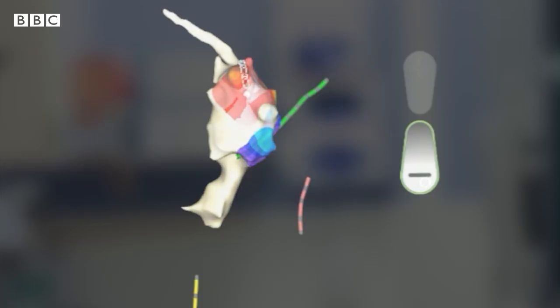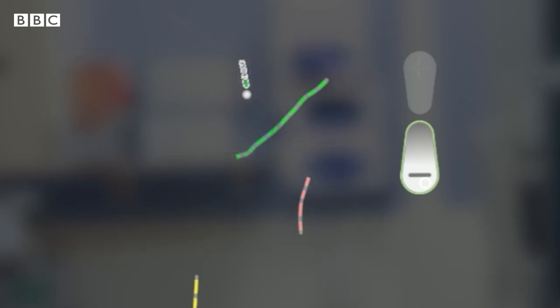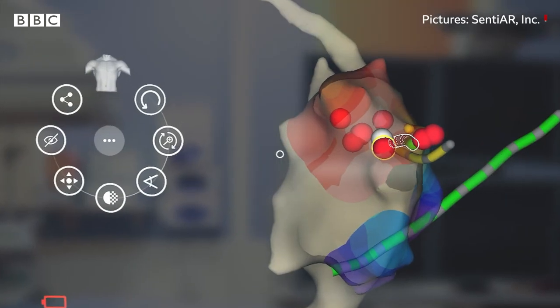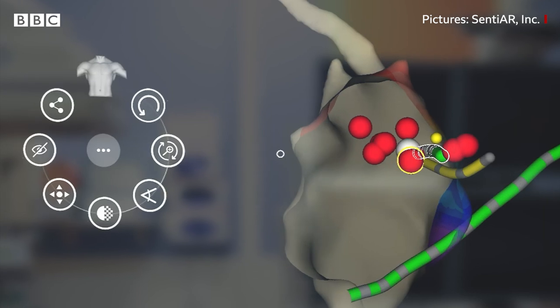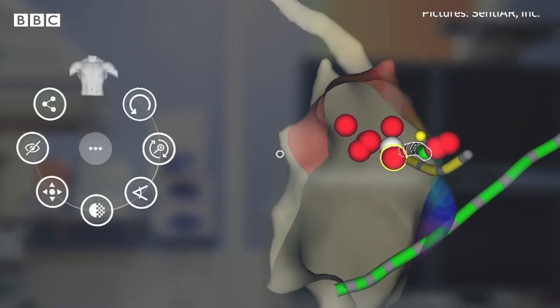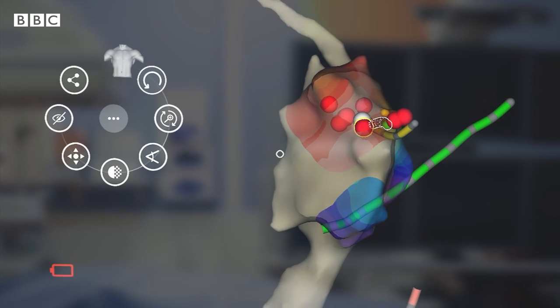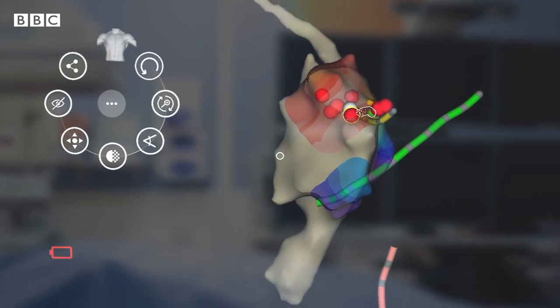We give them real-time information of where the tools that she's put in the heart are, and the map of where that electrical signal's traveling, and how it changes once she makes a lesion, or she destroys some of the tissue that's causing the problems.